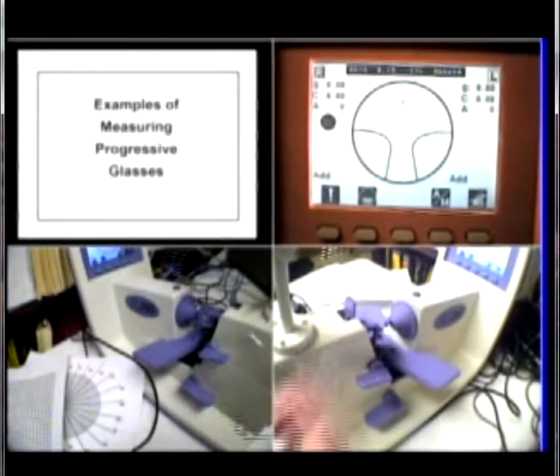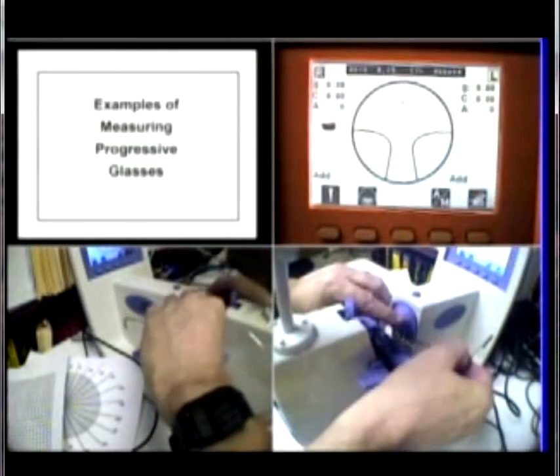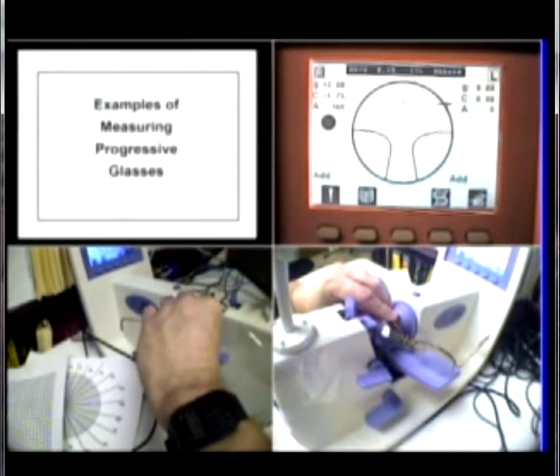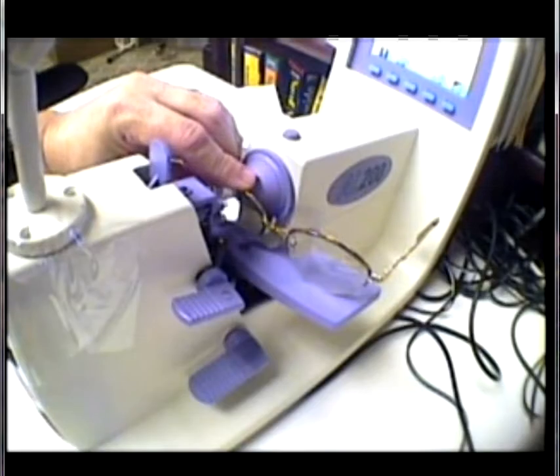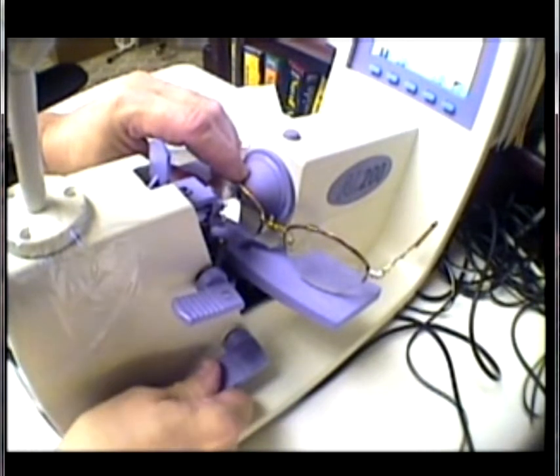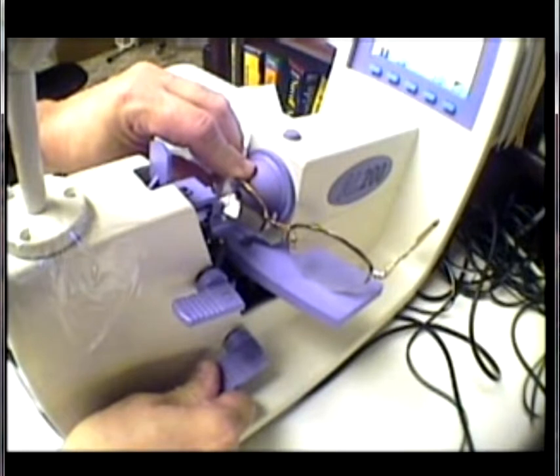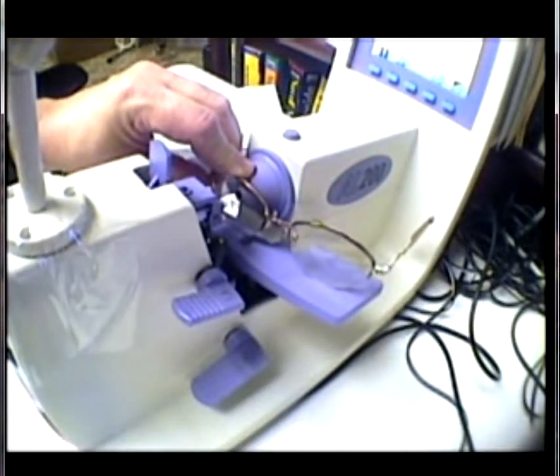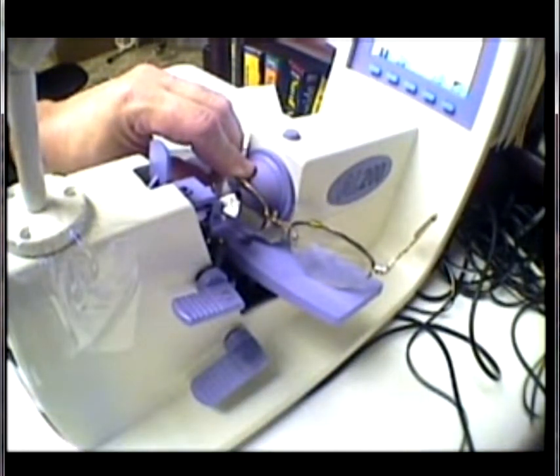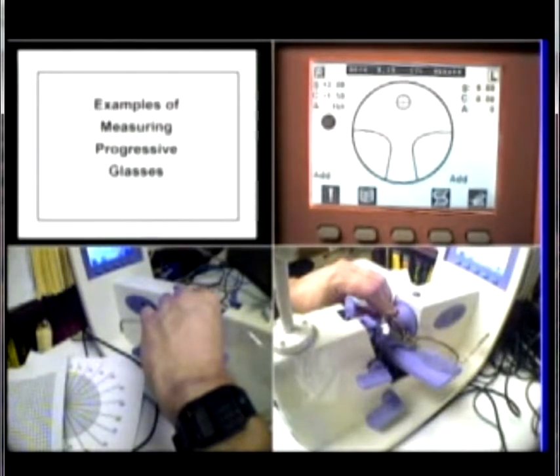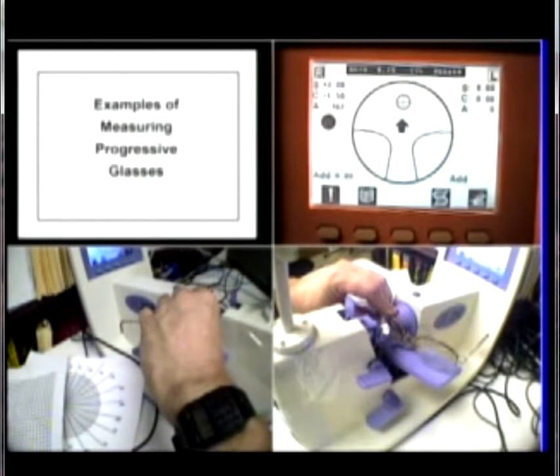So I'm going to switch the instrument to the quad mode. If you look at the pair of glasses, I need to get it up just a little bit. So I'm practically centered, and I'm going to see the quad mode. It tells me I should go slightly to the right. I've got a measurement.